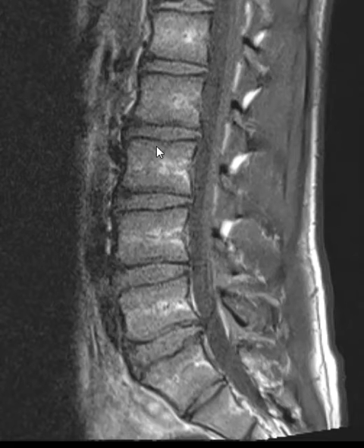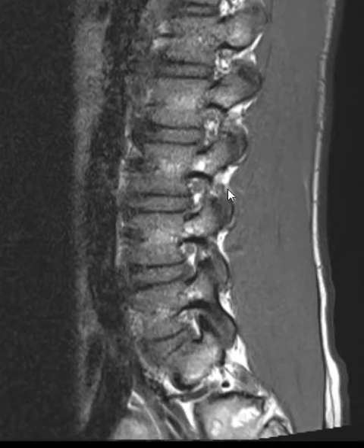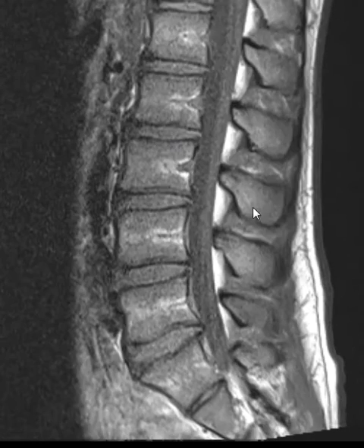Their marrow is not very fatty, so their vertebral bodies don't have much signal here. But if we go to the right-hand side, looking for a PARS defect, things look good — vertebral bodies look good, all the discs look good.